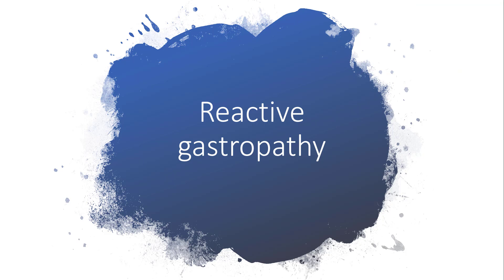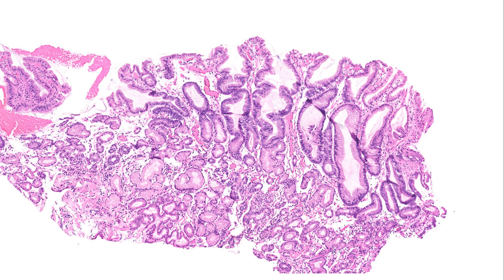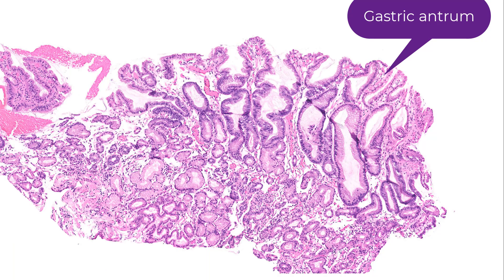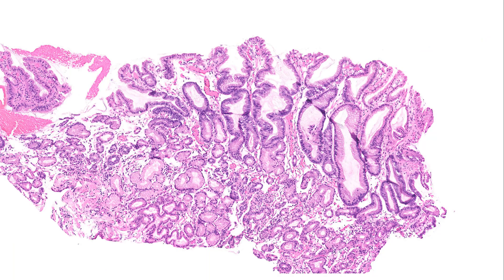Let's talk about reactive gastropathy. This is a perfect example of it. As you can see, this is the antrum. Reactive gastropathy is best seen in its majestic form in the antrum. In the body and fundic mucosa, the changes are muted and tend to be very subtle.